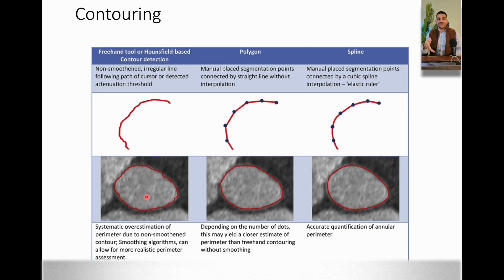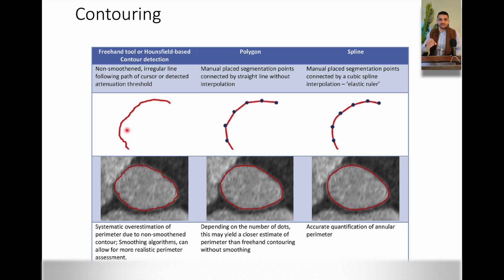What about contouring? This is how we do it in the step-by-step approach. When you use the pencil freehand, your perimeter will increase because the irregular line follows the path of the cursor — fine movements are all accounted for in the perimeter. However, the closed polygon is the most accurate method, and this is the one I use in order to get an accurate perimeter and an accurate area.